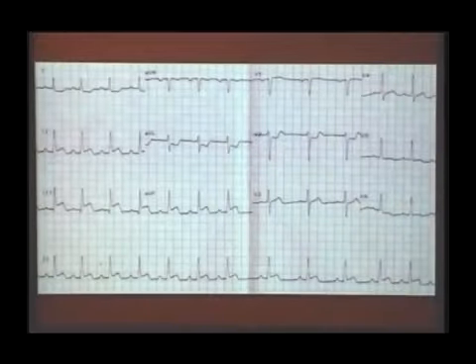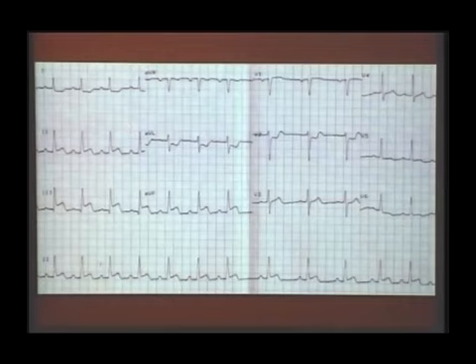So if the ST is going to come towards your inferior leads, it is going to go away from your superior leads. So superior leads will show what? ST segment depression. Whenever you have an ST segment elevation, L1 and AVL showing ST segment depression is called reciprocal depression, which indicates the ST vector is acutely coming towards inferior leads and going away from your high lateral leads. The posterior ST depression you see here is a reciprocal depression of posterior ST elevation, isn't it?